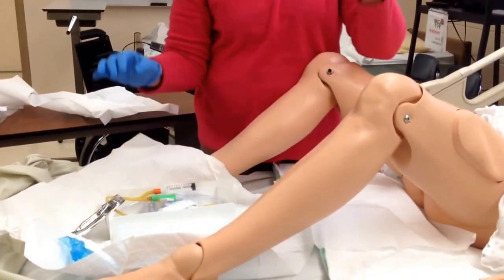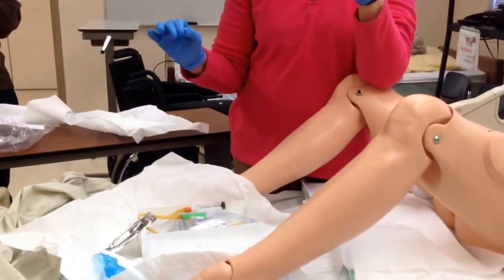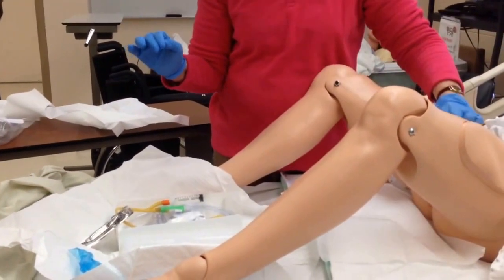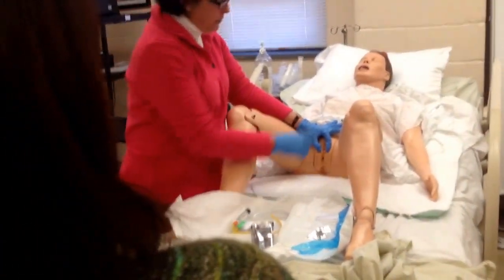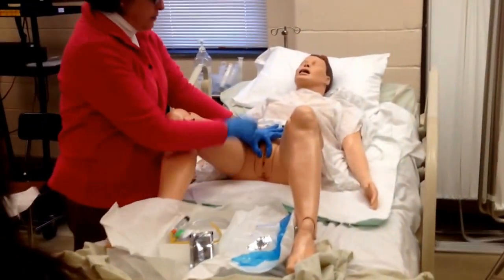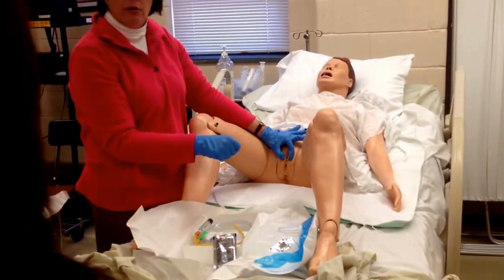So what you're going to do next is separate the labia, okay? Because you need to get that good visualization. So you separate, and once you start separating, this hand is now considered contaminated, okay? So you can't let go. So you take one swab stick, you go down one side, toss it. Pick up another swab stick, go down the opposite side, toss it. The last one goes down the center, okay?